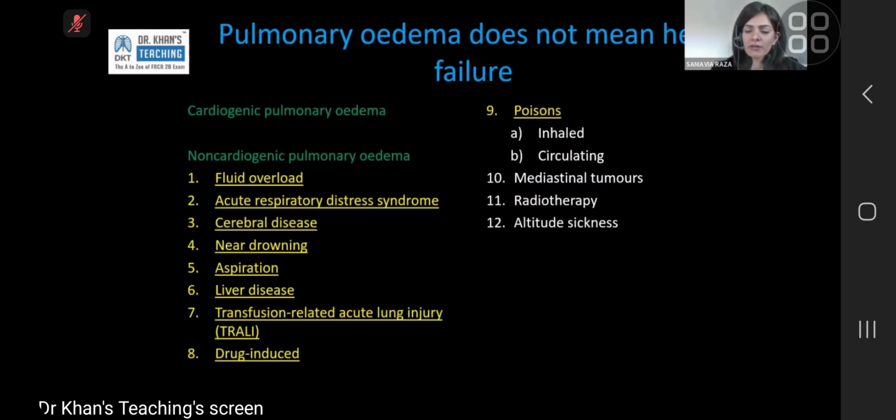People can go from non-cardiogenic causes of pulmonary edema that put so much pressure on the body that they ended up in heart failure. So they ended up with a mixed picture. They started with non-cardiogenic, but now it is a mixed picture or a full cardiogenic appearance of pulmonary edema. The lung appearances alone can't point you one way or the other. The thing with pulmonary edema, though, is it changes very rapidly on chest X-ray. So the film before, the film from yesterday, and the film from tomorrow will be drastically different. And the only thing that moves that quickly between imaging is fluid. So that's one way of telling whether a patch of consolidation was actually fluid or infection.